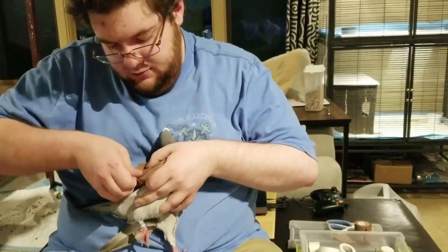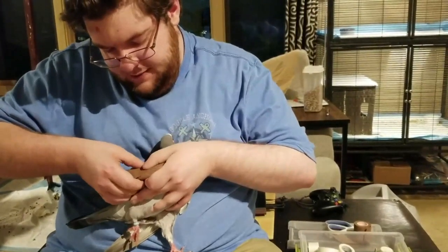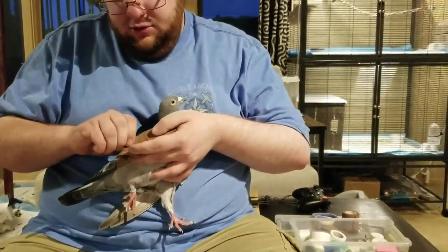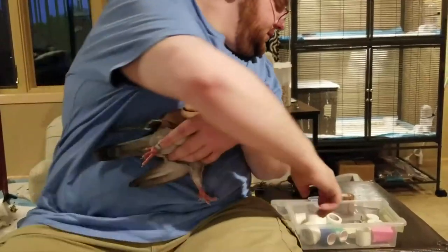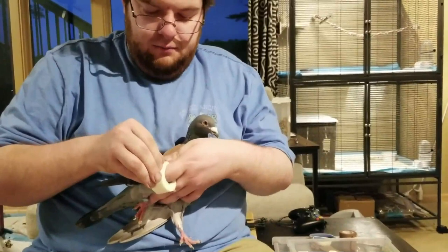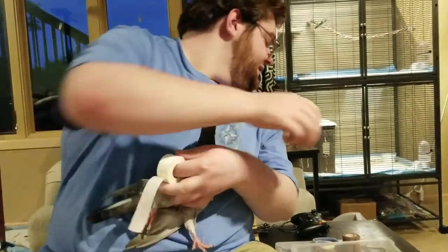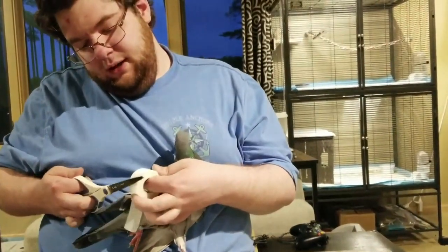Once it gets around, I like to give a little pull and compress it on a little bit so it sticks to itself better. Sometimes you can tuck it in underneath itself and give it a push — that holds it well too. But my little secret is to use your more sturdy medical tape. This one is DuraPore. You can use MicroPore too, but this is a little heavier and stickier. Take that, grab your scissors, and clip it.